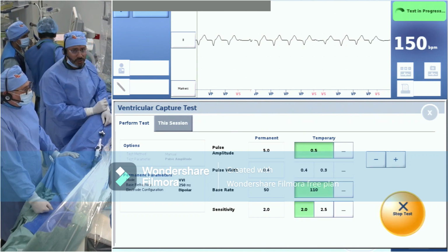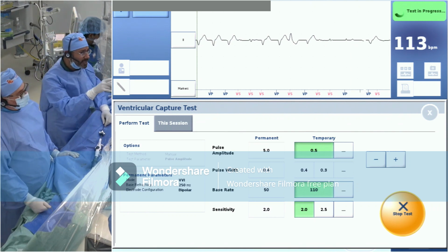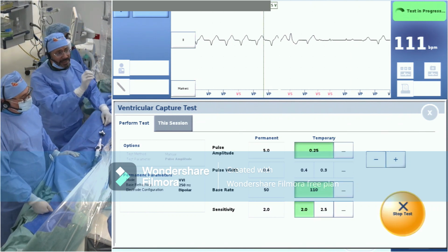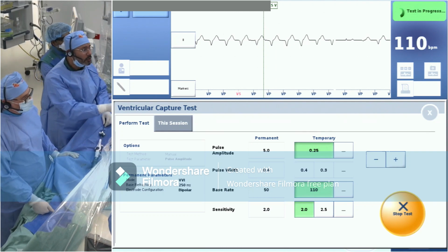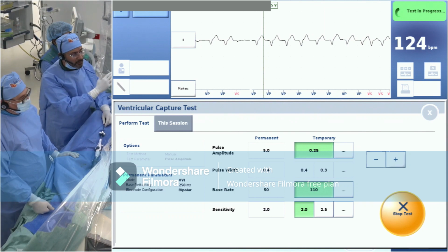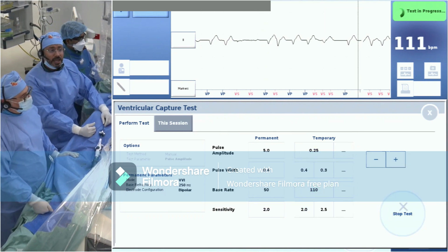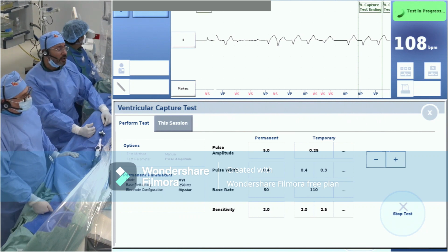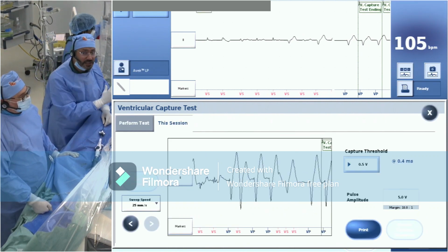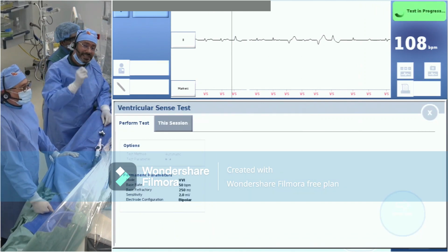Regarding the first question, which is a very good question regarding the PVCs, what you're seeing now is a complex interaction between the temporary pacemaker, my catheter movement, and the device maneuverability. From what we saw, after stabilizing the device and removing everything outside of the patient, you will not see these PVCs coming. If you see a PVC after the procedure, you have to be worried, especially if the patient doesn't have a previous history of PVCs, that the device got displaced and you have to go and snare it.